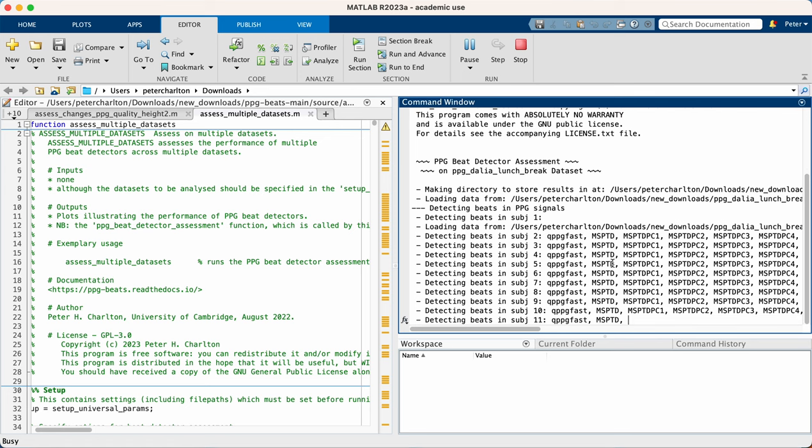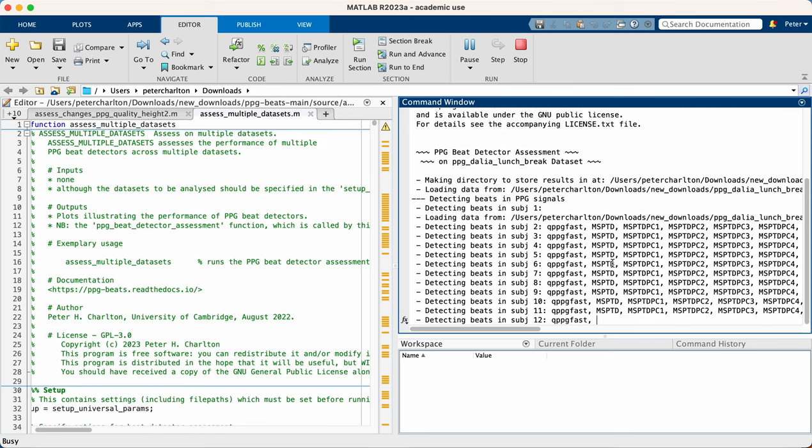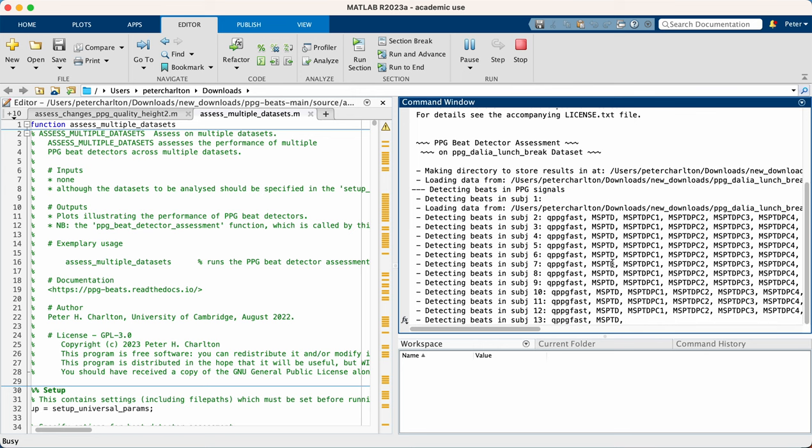In a moment, it will also detect beats in the simultaneous ECG signals, which act as our reference. And then it will collate the statistics on the performance of each of these different versions. So we'll rejoin the tutorial in a moment, once it's gone through that process.